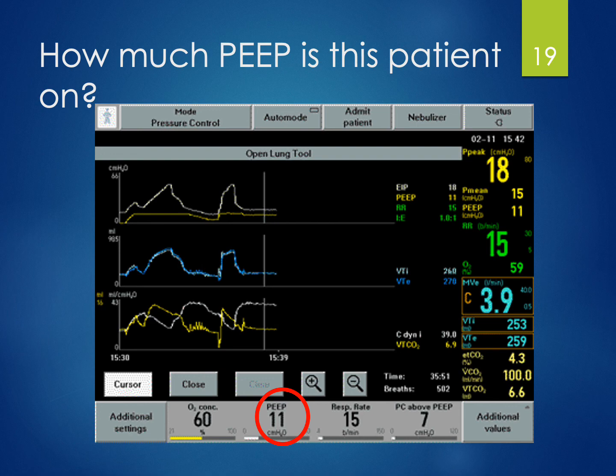Now, one important thing to remember about PEEP is how it can be used to enhance oxygen delivery. So remember how those alveoli in the previous slide were close to the vasculature when we had good PEEP? They were able to pick up carbon dioxide and deliver oxygen to the blood better. Well, when you have a patient who might not be doing well, let's say you have somebody who is having to have their FiO2 turned up. So we started at 30, but they're not doing well. We need to turn it up to 40. Oh, we had to turn it up to 50% and then 60%. Well, instead of just constantly turning up the FiO2, we can actually consider increasing the PEEP.